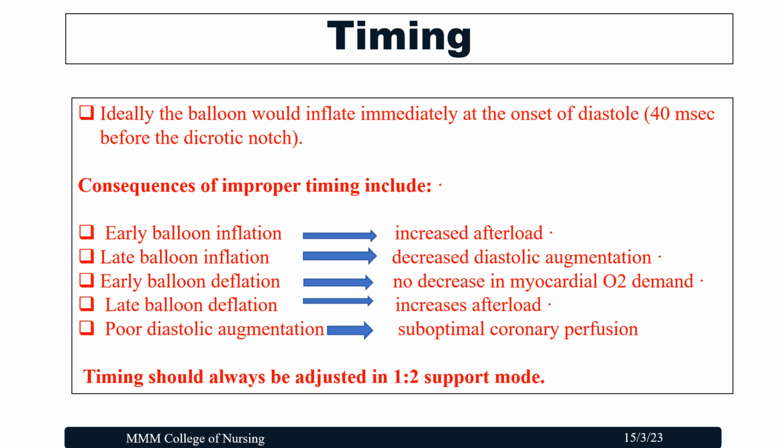Timing. Ideally, when should the balloon actually inflate and deflate? What is the set timing? Ideally the balloon will inflate immediately at the onset of diastole, that is 40 milliseconds before the dicrotic notch appears in the waveform. So what are some of the consequences of improper timing?